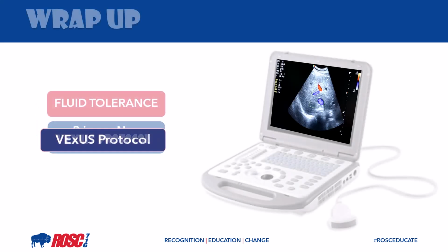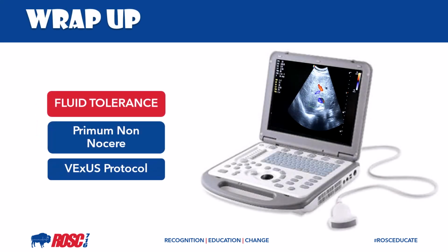So where does this bring us? The concept of fluid tolerance is relatively new. We need to continually search for evidence of fluid intolerance and venous congestion prior to administering fluids. We need to focus our efforts on doing no harm in relation to fluid resuscitation. In closing, I need to remind you that this is a proof of concept paradigm. However, the VExUS ultrasound protocol and grading system may be the best tool in our toolbox at this time when it comes to fluid tolerance assessment.